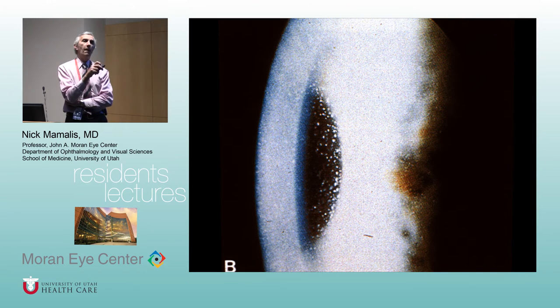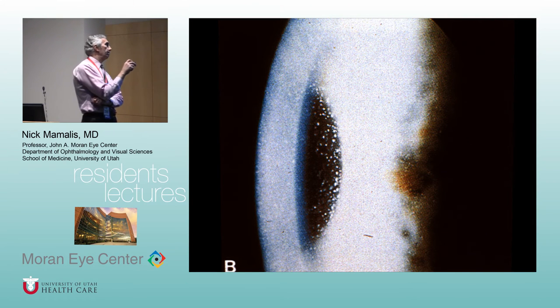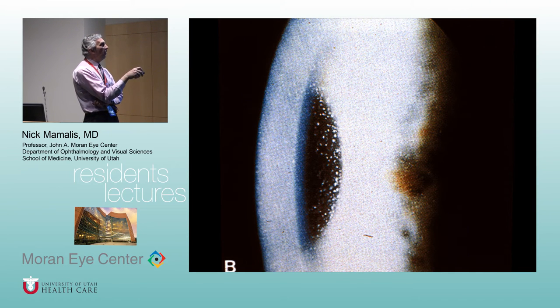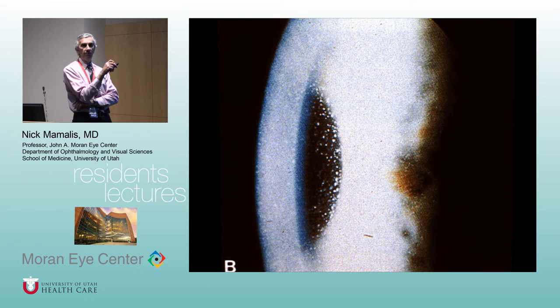Reese, what do we see in here? Just lots of little dots scattered. Yeah, so again, hard to see with the beam, really difficult, but they're more superficial, and they're forming little discrete dots. What dystrophy gives you these discrete dots? Would it be macular? How about more superficial? Not yet in the stroma. We're still in kind of Bowman's subepithelium. Give me an M. Starts with an M.